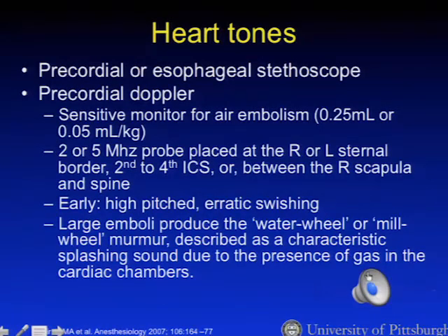A word about heart tones. I'm going to discuss precordial Doppler specifically in the setting of monitoring for air embolism. It's a sensitive monitor with a lower limit of detection down to less than 1 ml of air.